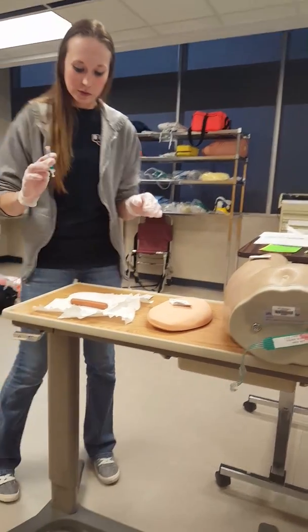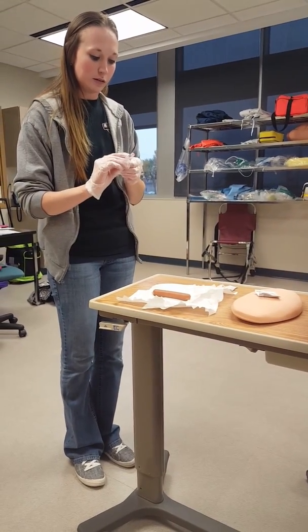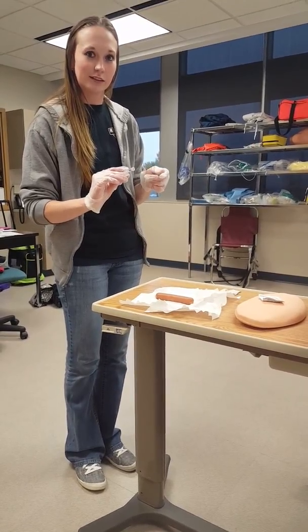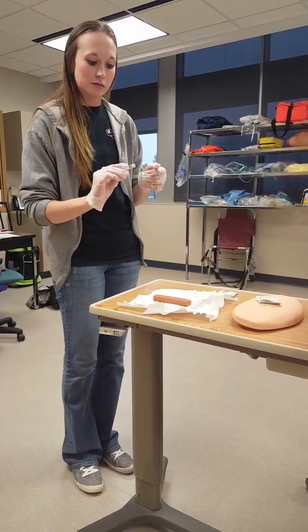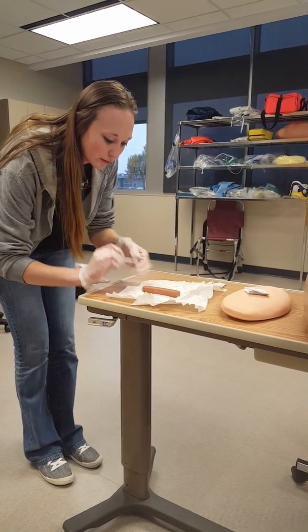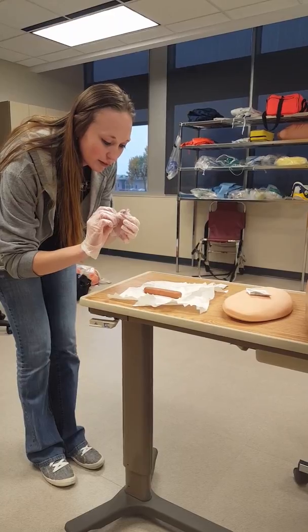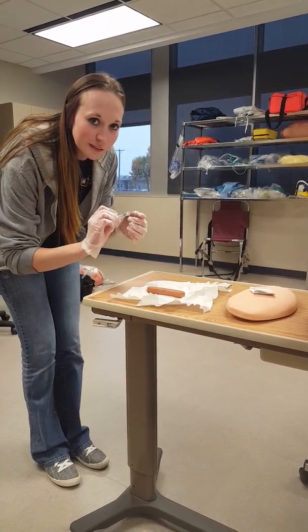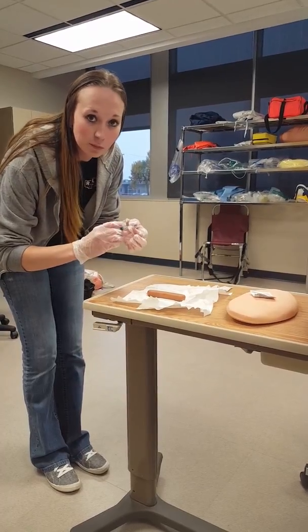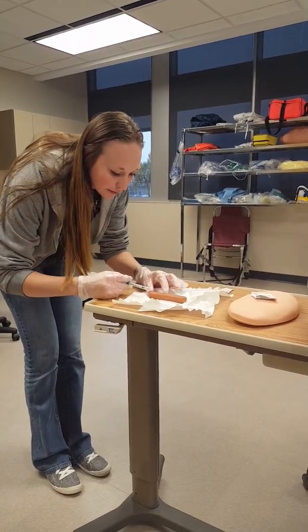All right. So then I would have this angle at, is it 45 degree? 90. Oh, now for this one I don't do that. So I just have it like, what is that called? Bevel. Oh yes, the bevel. I would have my bevel faced upward while I'm inserting it in.